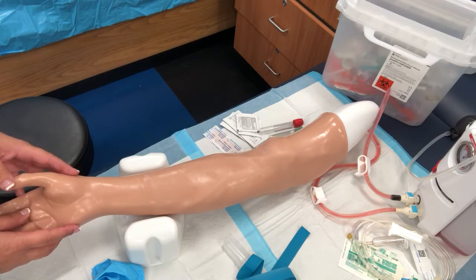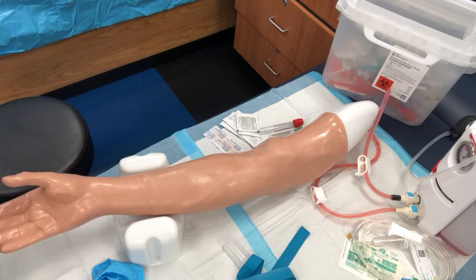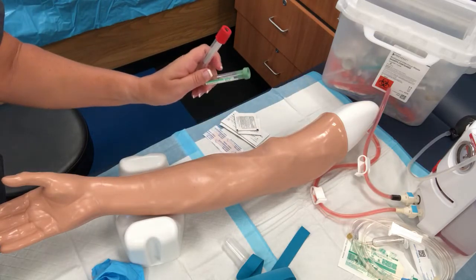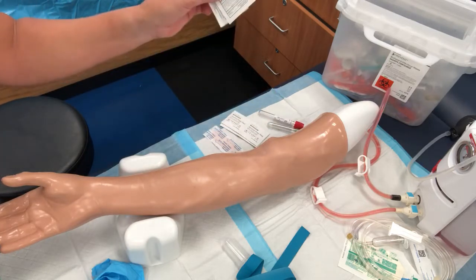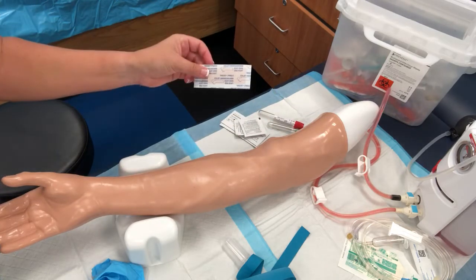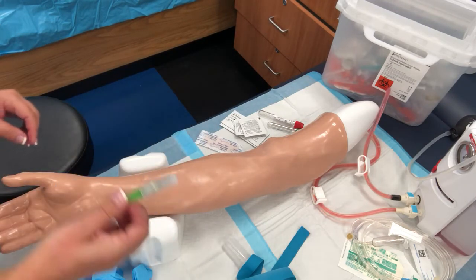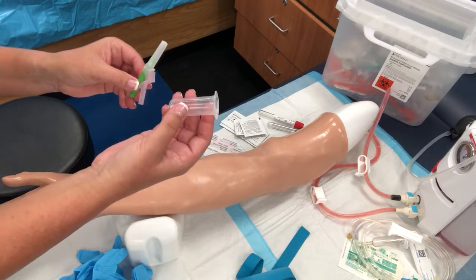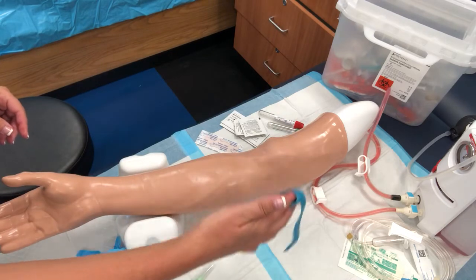on a regular patient. We've collected everything else that we're going to need for our venipuncture, so we have our prescription, which tells us exactly which vacutainers we need in terms of what laboratory values we're obtaining for our patient. We have some alcohol rub, we have a Band-Aid, we have our gloves, we have our safety needle, which is actually going to insert into our adapter. We'll go through that in just a moment. And we have our tourniquet.